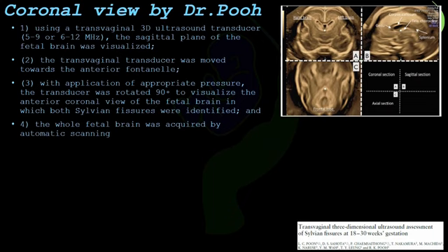Here, why are you applying pressure? Pressure means you have to stabilize the head such that the fetal head does not move when the transducer is rotated.